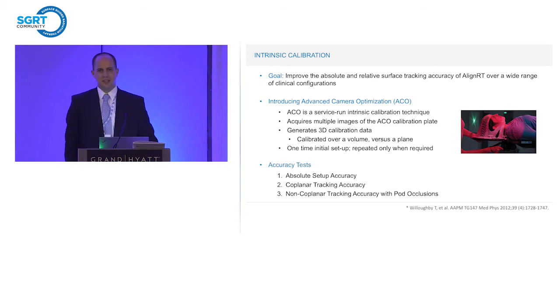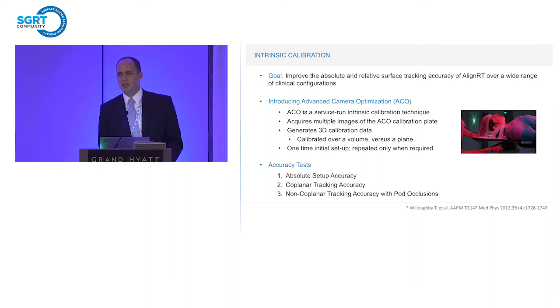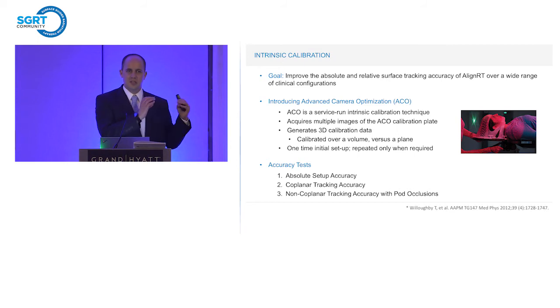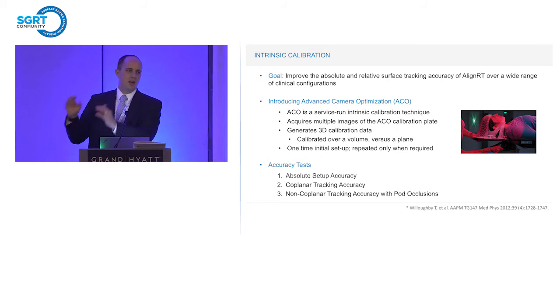So how do we test this? Following some guidelines from TG 147 and some in-house testing, we set up a series of 3 different tests, as you can see here. The first one is absolute setup accuracy. This is taking the phantom and running through a typical workflow as if it was a patient, going from the CT process, the planning, and to setting up the patient using surface guidance, and we're seeing how well we can set up this patient compared to internal CBCT imaging.